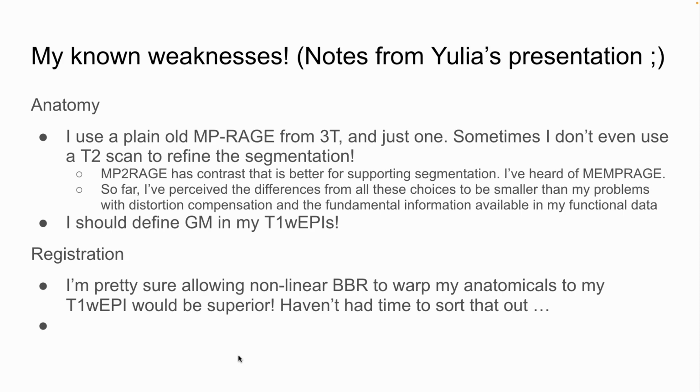So, belying my ignorance, there are users in this room who are more familiar with AFNI than I. Does AFNI have a functional, high-quality, boundary-based registration algorithm built into 3dAllineate? Does anyone know? I haven't been able to find one, and if it did, I would use it in a heartbeat.